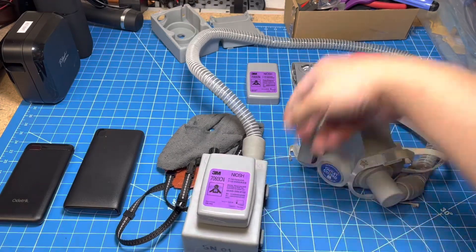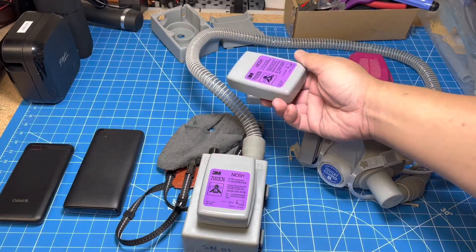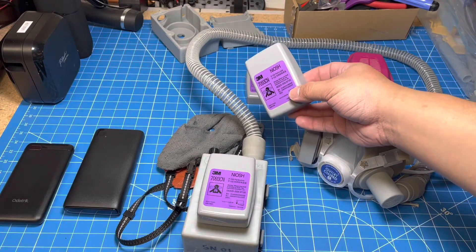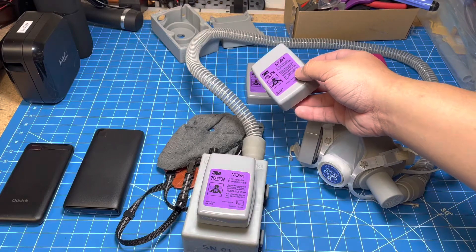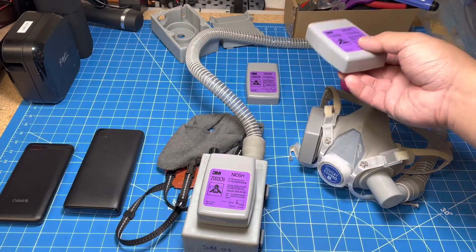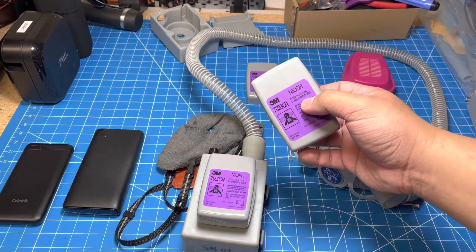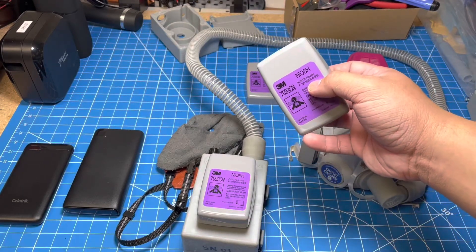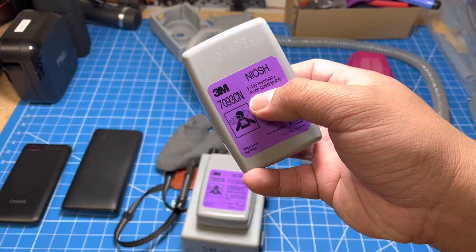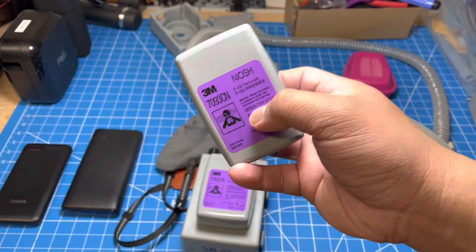We've designed our PAPR to use these bayonet-style filter cartridges. The great thing about these is they're a lot longer-lasting and more reusable than disposable N95 masks or surgical masks. They're available in a wide variety of different styles and models, so if one of them isn't available, there's a good chance you can find another one. One quick thing to note is that not all of these filter cartridges are rated for particulates — some are only for organic vapor. So you want to make sure it has a P100, N100, P95, or N95 particulate rating to make sure you have the right one.